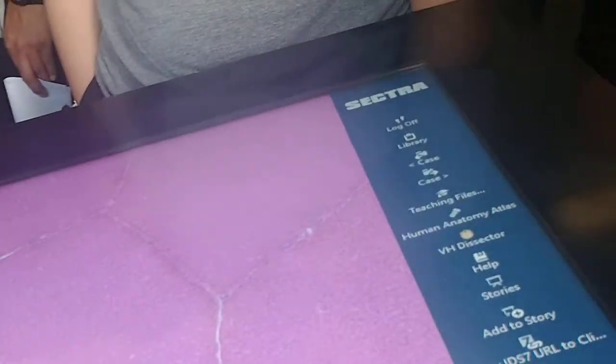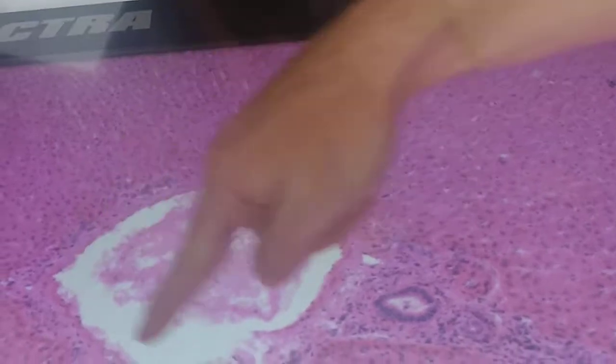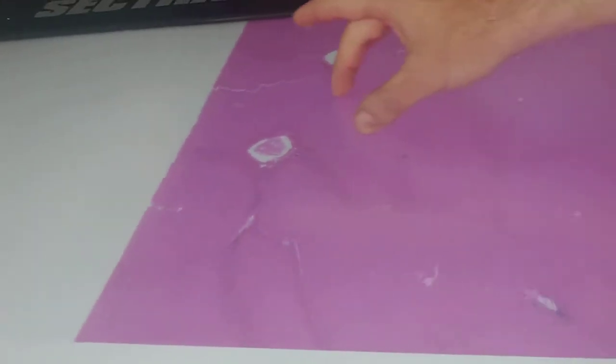So this one is venous. This is going to be a hepatic vein, likely because of its size. All of these lobules are feeding into this hepatic vein, which means that's probably one of my segmental hepatic veins, because there are 8 segments.